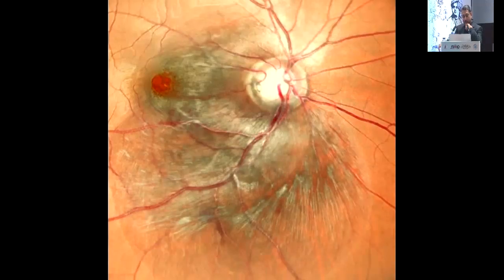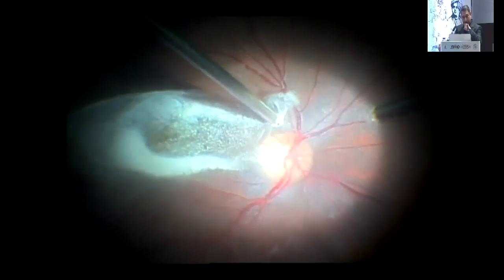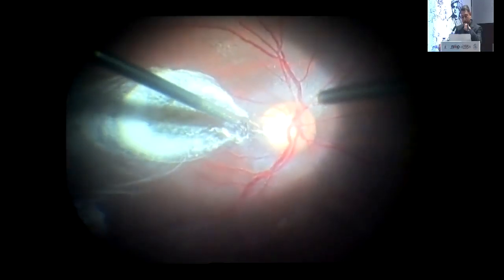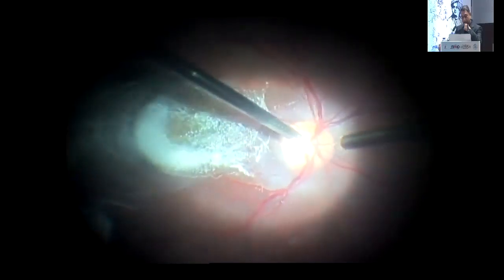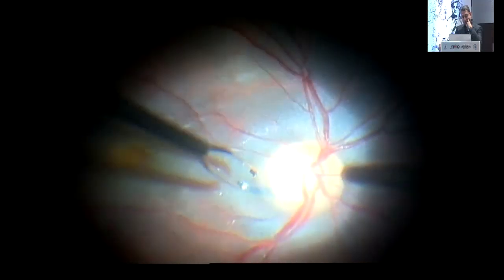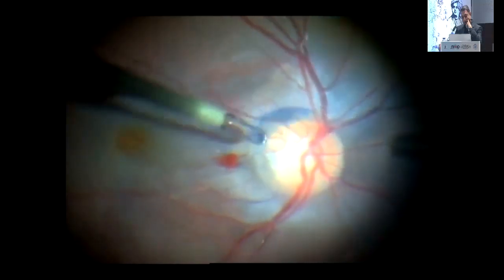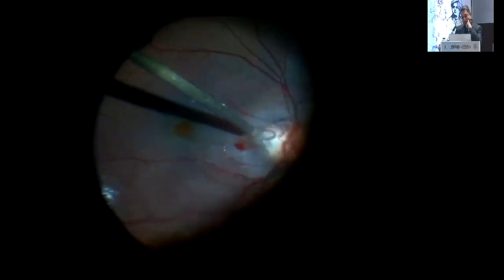Although pars plana vitrectomy is considered the gold standard for the treatment of optic disc pit, OCT showed an impending macular hole and multi-layered fluid in the macula as well as areas inferior to it. We decided to do a vitrectomy with ILM sealing of the pit and inner retinal fenestrations away from the macula. Special attention was given to release the vitreous over the area of the pit. For fear of inducing a macular hole, peripapillary ILM was peeled in a petaloid fashion and inverted onto the surface of the disc with the help of a PFCL bubble.